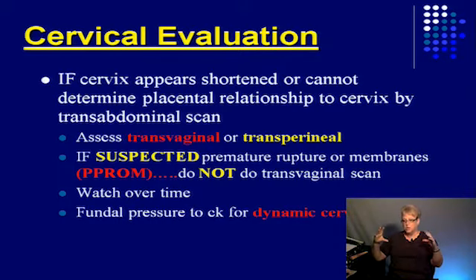So we do watch for 2 minutes. We apply some pressure, watch for 2 minutes, scanning back and forth to make sure that there's no change in that cervical length. We document without pressure, then we put pressure, write up the pressure, and then we scan and we watch. So your dynamic cervix looks like it's closed because there's no pressure, and with pressure, it just opens right up. And then you're waiting and getting the shortest length. You're measuring the residual length.